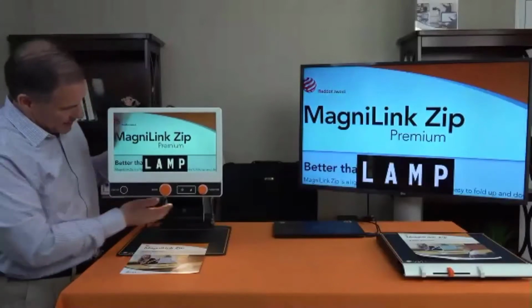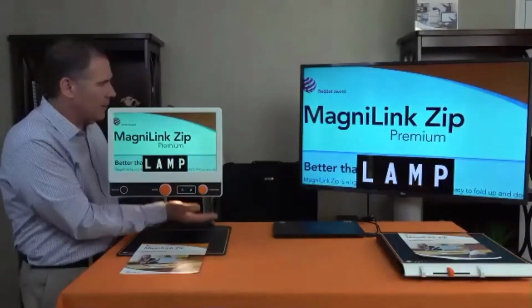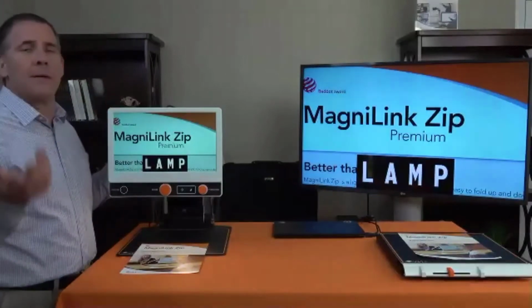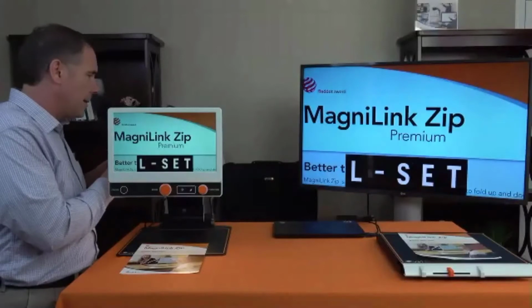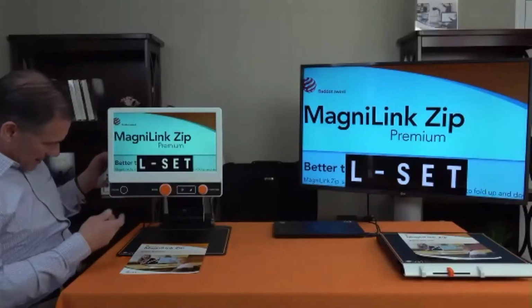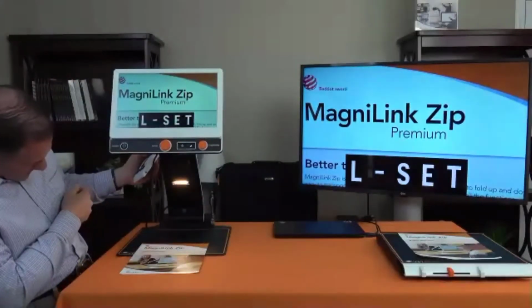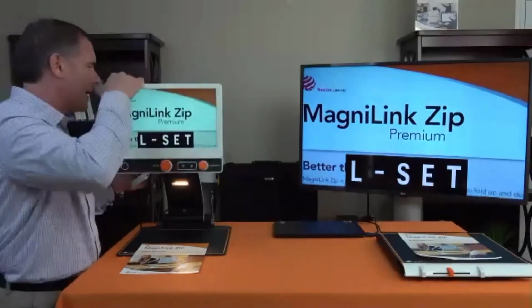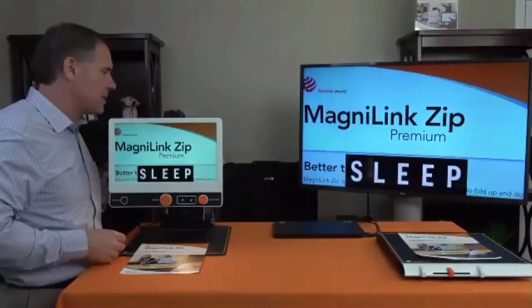Lamp, there's the lamp here. You see it under here. Well, I don't know if you see it, but I'm holding my hand under it. And the lamp obviously gives you light. Now, I don't even need it right now. There's plenty of light in here. So I would go into the lamp, and then I could go ahead and turn it down. Oh, I turned it off. Let me see if I push this up, and then you can see it come back on there. So it's a rheostat. I can dim it or go fully bright. I love that. And now I'm going to go back out. It's all set. I'm going to go to the next function, sleep.